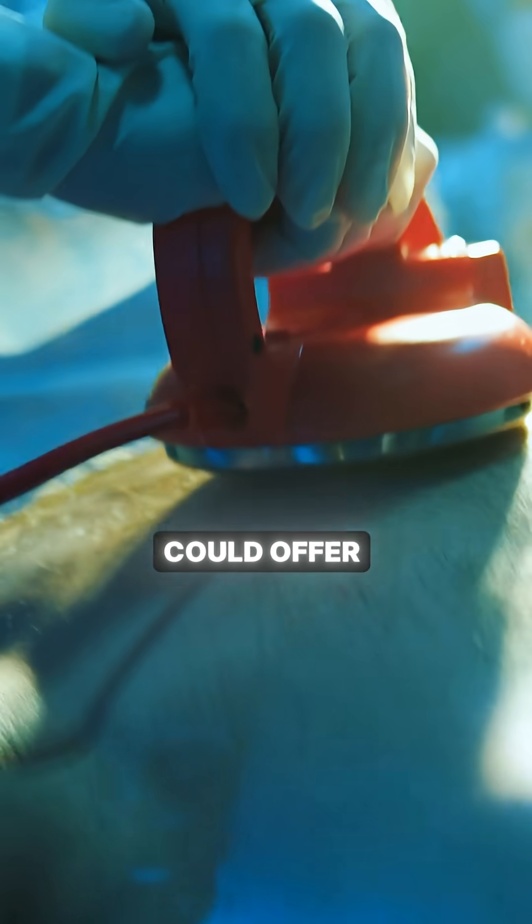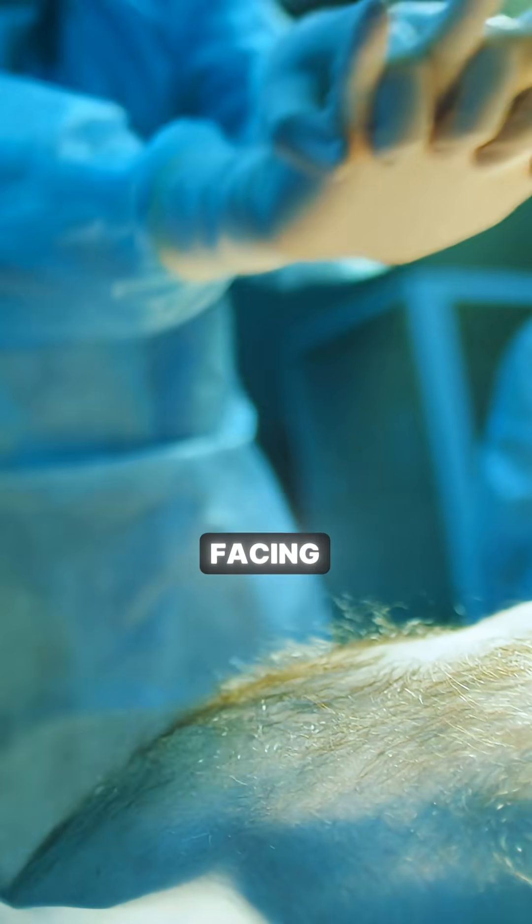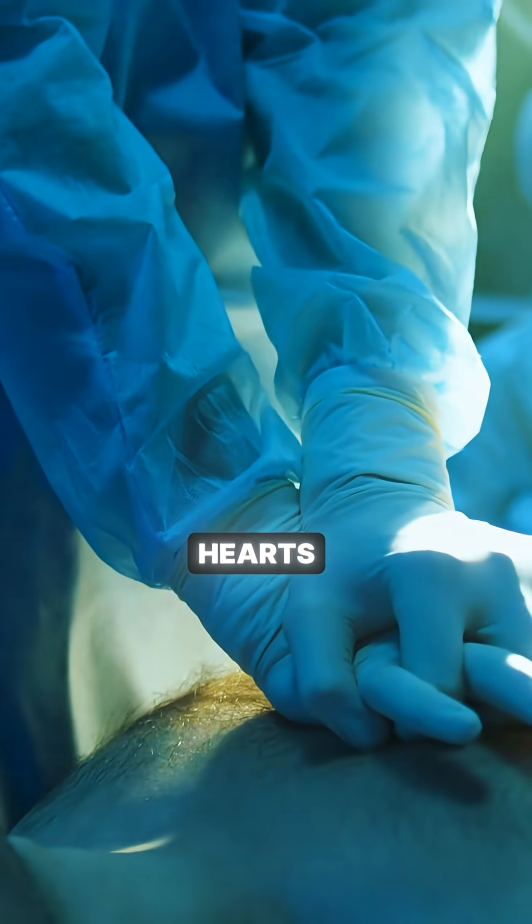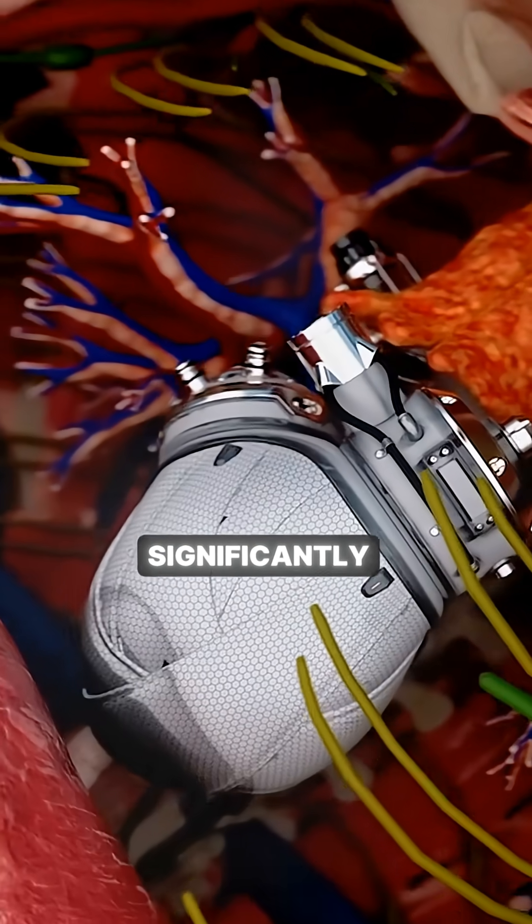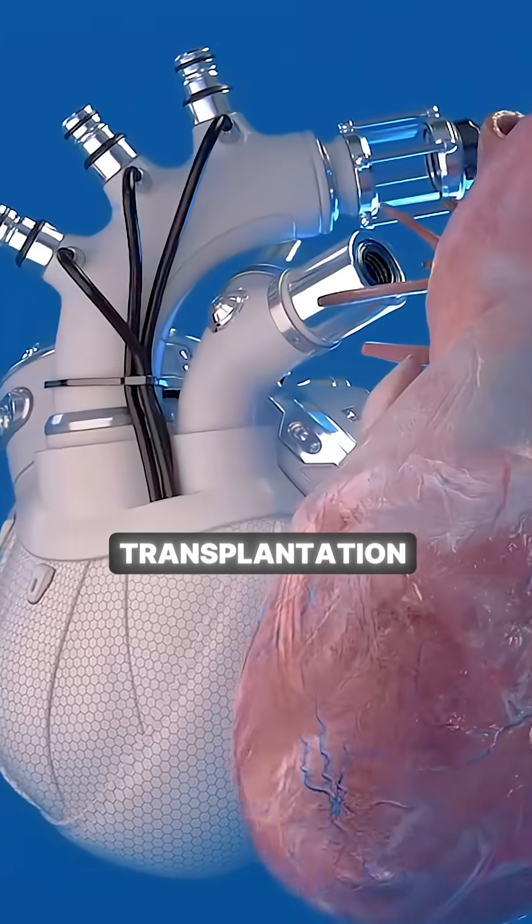Clinicians hoped the technology could offer a long-term solution for patients facing extended waits for donor hearts. If successful at scale, the artificial heart may significantly reshape the future of cardiac transplantation.